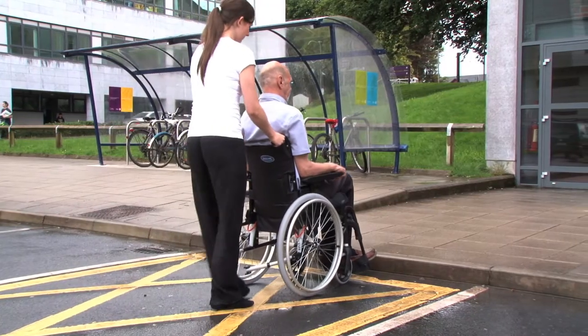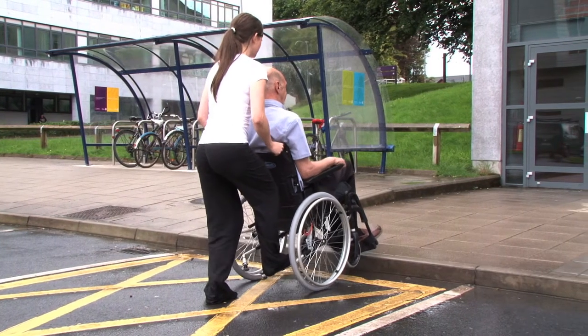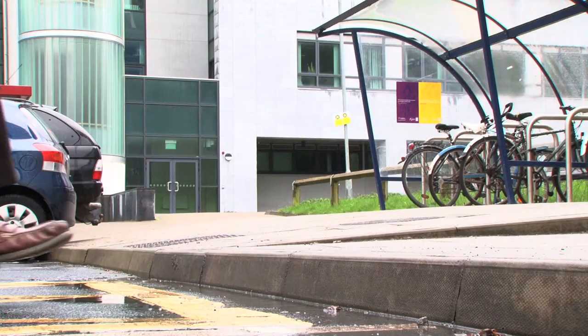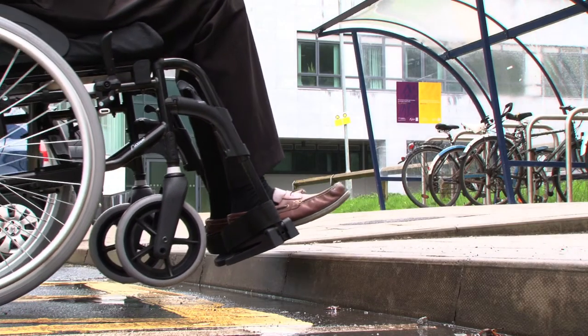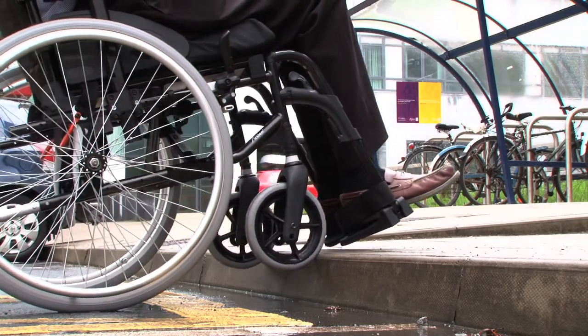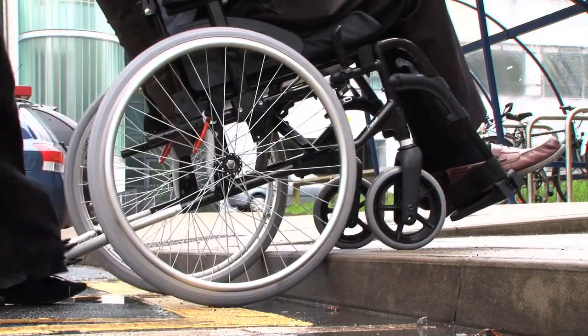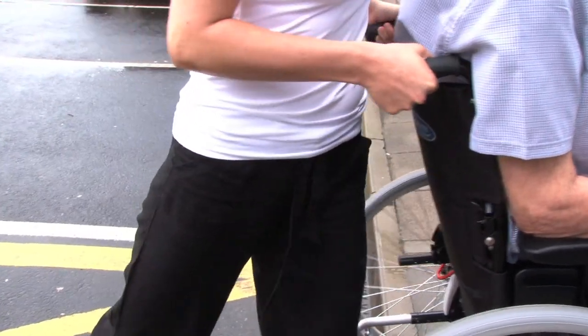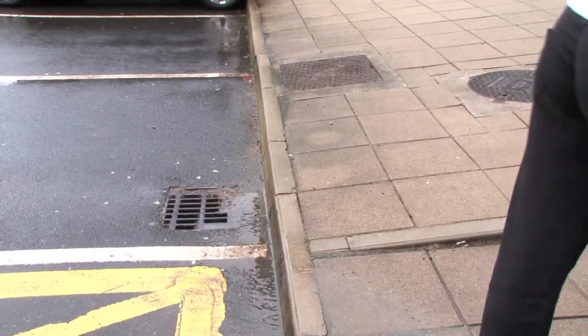To go up a kerb, the caregiver brings the wheelchair so that it is facing the kerb. The caregiver uses the tipping lever to raise the front of the chair so that the front wheels clear the kerb and are placed on the pavement. Standing close to the back of the wheelchair, the caregiver pushes the wheelchair up the kerb.